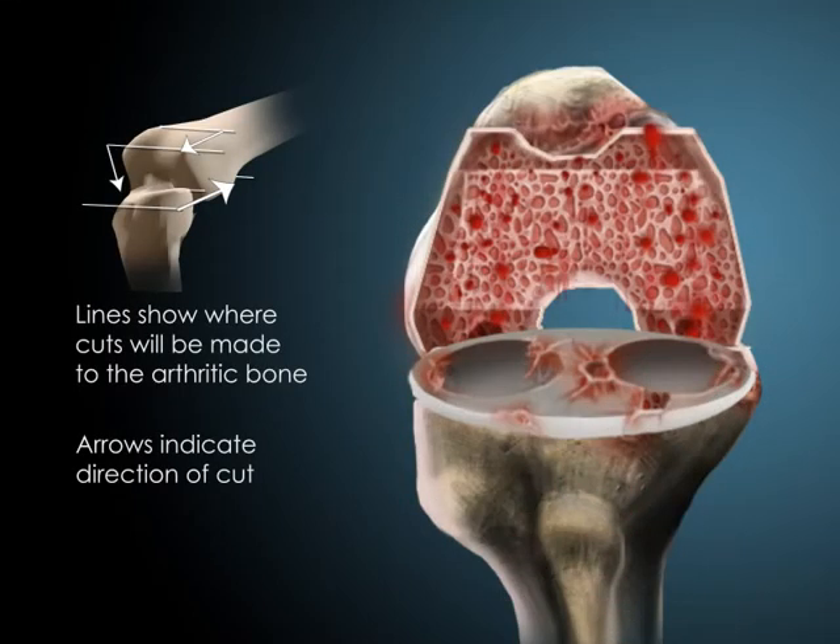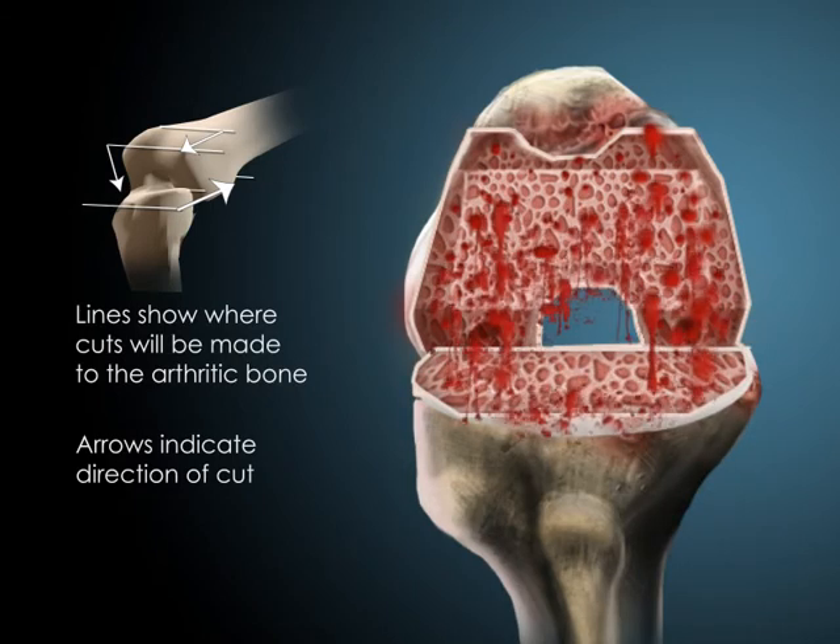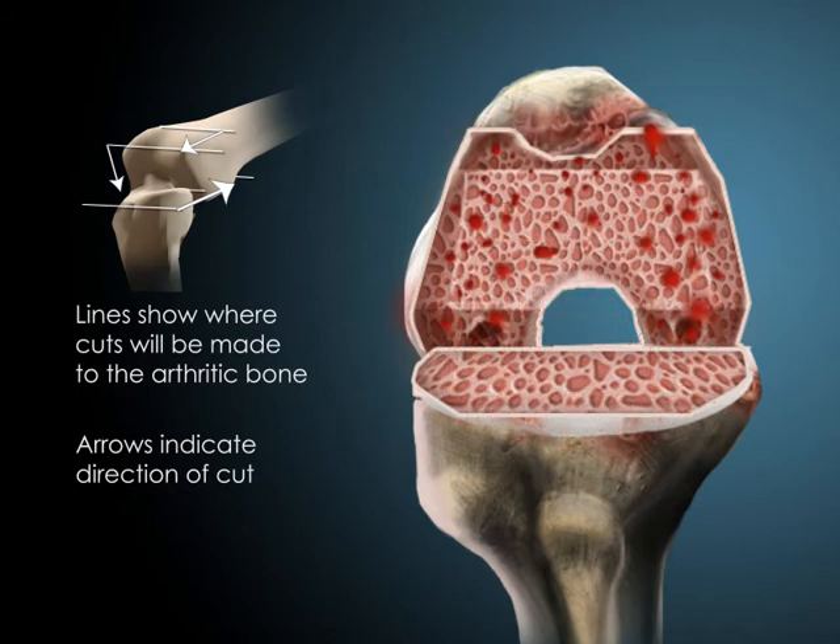The degenerative bone surfaces or meniscus is then removed. Once the arthritic bone surfaces are removed, prosthetics are then prepared to be placed.